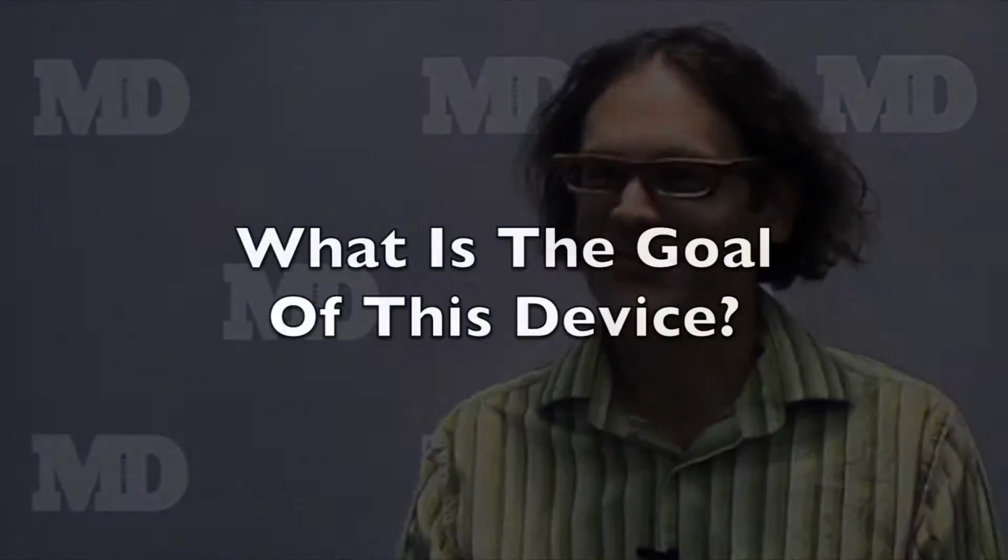In a lot of cases, it's hard to know if they had a seizure, especially for absence seizures, which are generalized seizures. In that case, we could probably place the device just about anywhere on the scalp and record these events. But what is hard for the person with the epilepsy to be able to do is record how often do they occur, how many times. Sometimes they have a lot of these seizures at night, and so they don't even know that they're having these seizures. And I think a lot of the data that has shown that this is a huge need has come from the NeuroVista trial where they had implanted EEG for long periods of time and recorded.